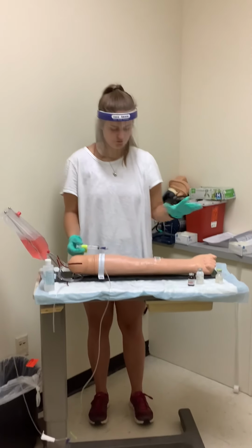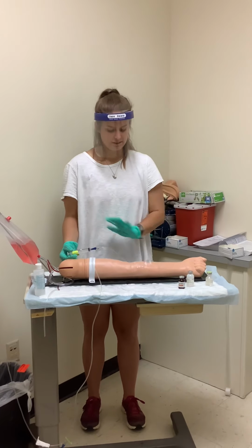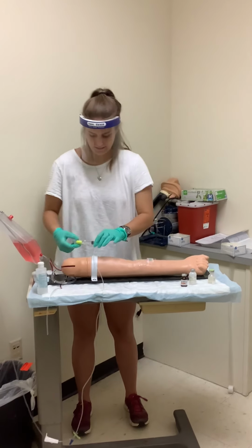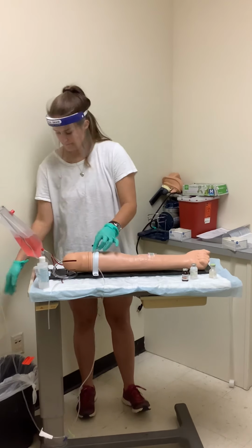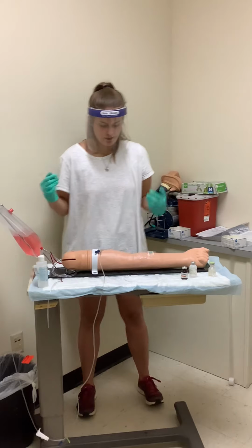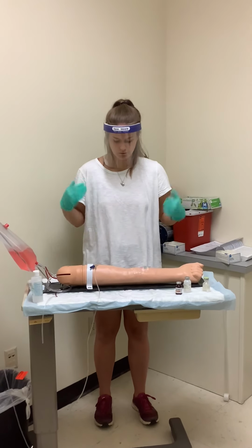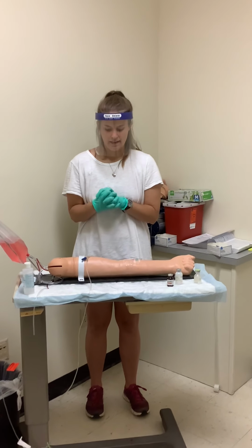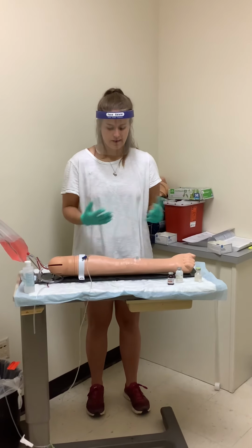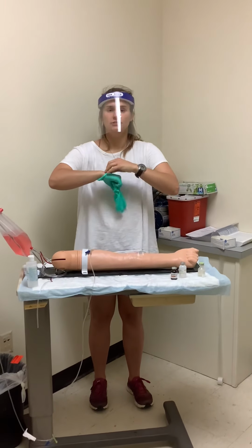I am checking the site for any redness, warmth, infiltration, or edema, and there is none. And I can clean off that, properly dispose, making sure that my patient feels safe and comfortable. The wheel's locked, bed in lowest position, call bell in reach, and have them let me know if they need anything. And now I will go properly document.